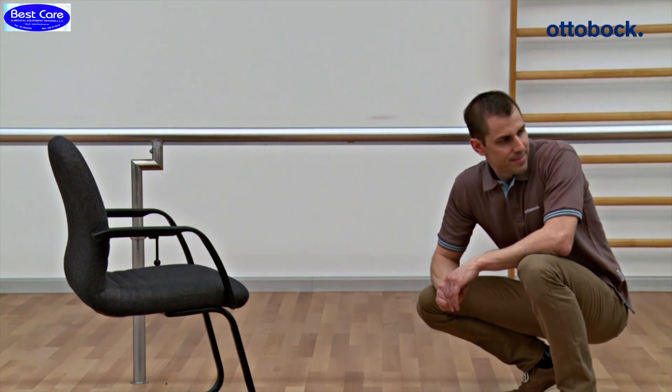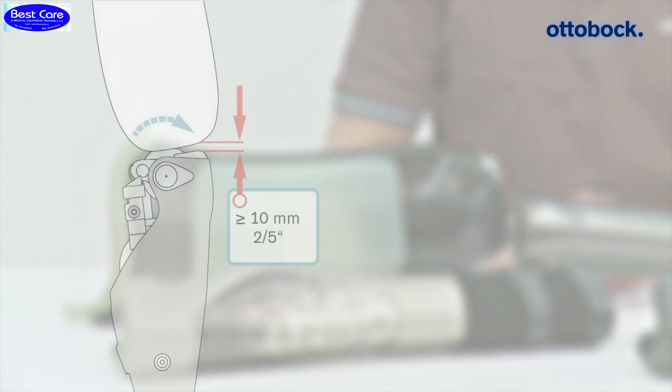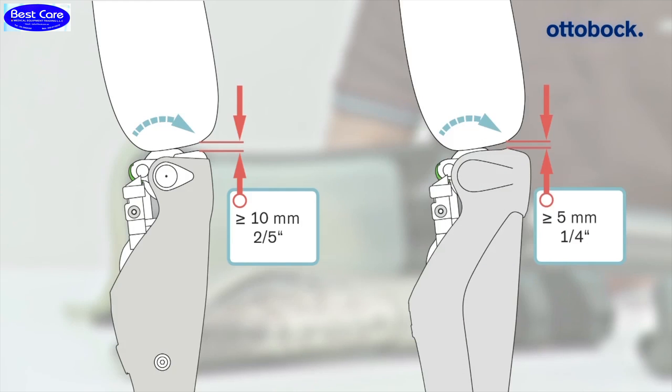If a C-Leg 4th protective cover needs to be installed later, the required safe distance between the prosthetic socket and main electronics increases from 5 mm to 10 mm. This is necessary as an installed protective cover reduces the available space by 5 mm.